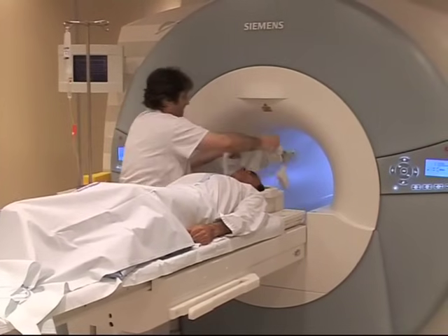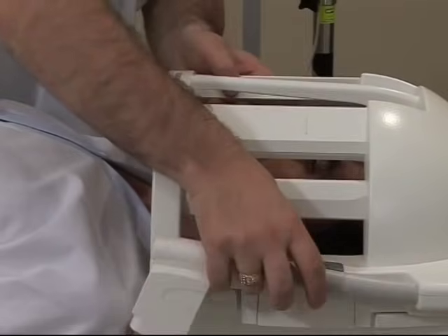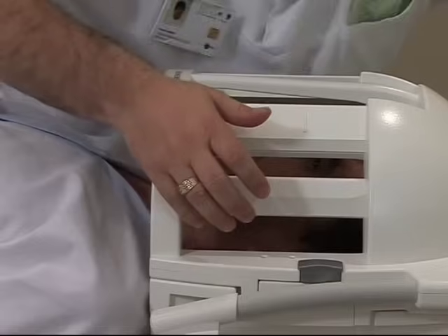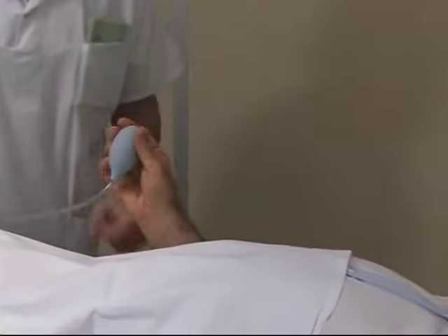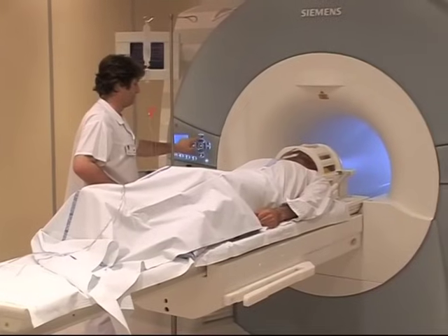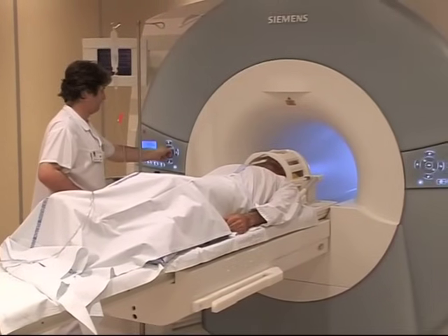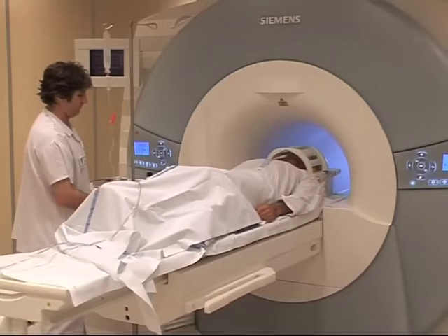The procedure goes as follows. You lay comfortably on your back. We place a strange box over your head — it's actually an antenna. Don't worry, it's not uncomfortable. This is a little pear-shaped bell. If you have a problem, you can call me by pressing on it. I'm placing it in your right hand. Then you are slid into the tunnel which is open at both ends. Now all you have to do is stay calm. You might even fall asleep.